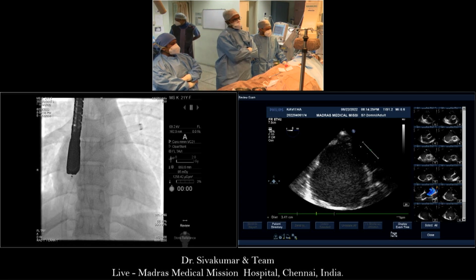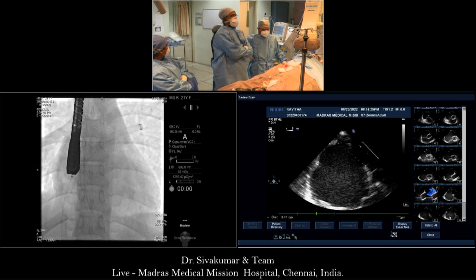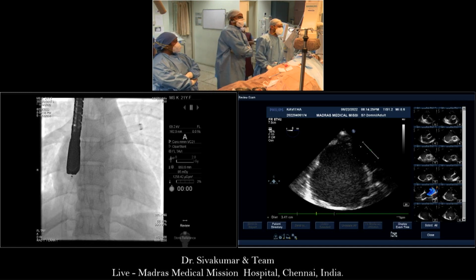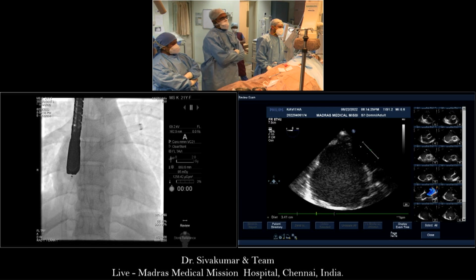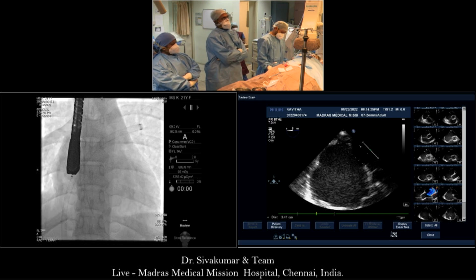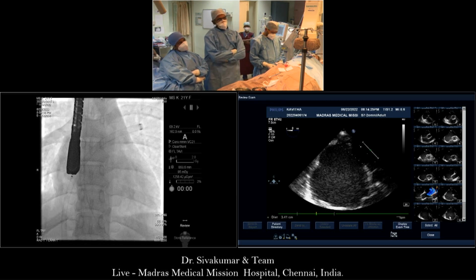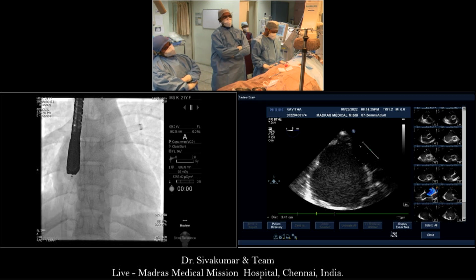Shiva, tell us your number, or not the number, but the device you were hiding in your hand. The measurements that we made, we had actually made a detailed assessment of this patient in the outpatient clinic with a transesophageal, and the measurement was 32 millimeter. So with an absent retroaortic margin and a relatively smaller posterior as well as inferior margin, the posterior margin was 5 millimeter and the inferior margin was also 5 millimeter. So we have decided that we are going to upsize the hole. We don't use balloon sizing. So for a 32 mil, tell me 40. Yes, I have decided on a 40.